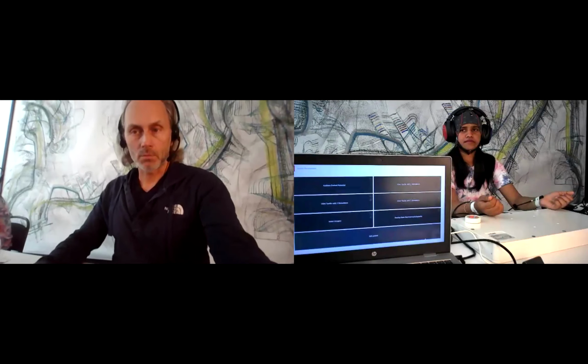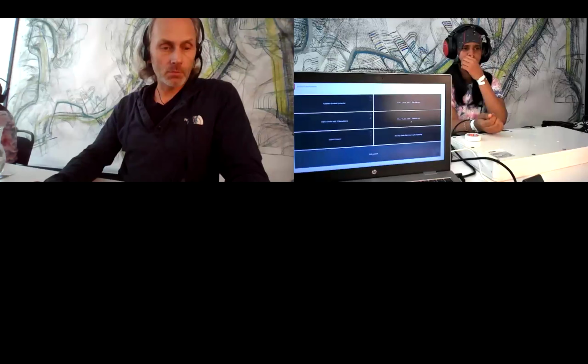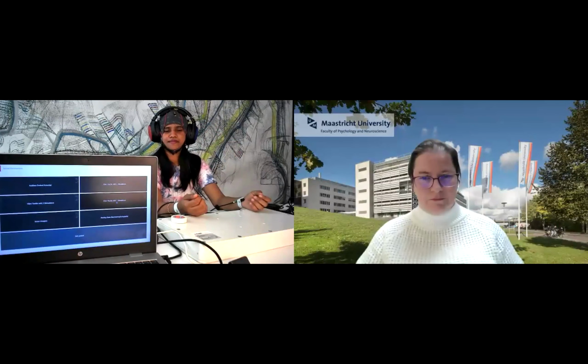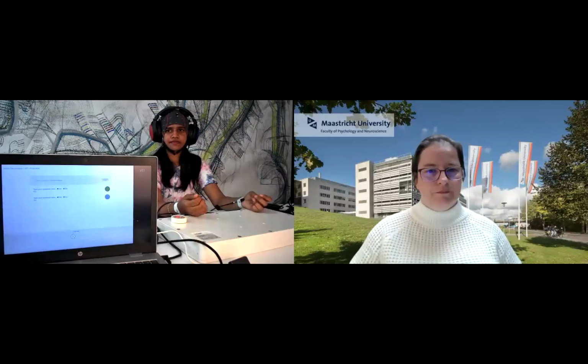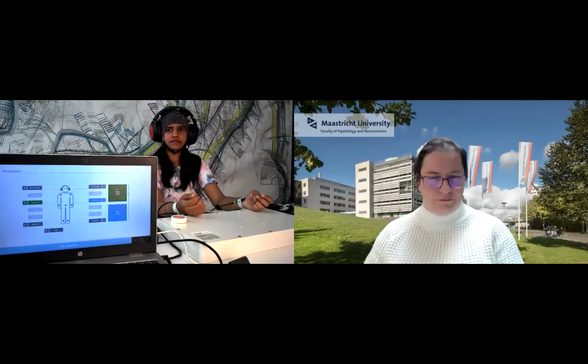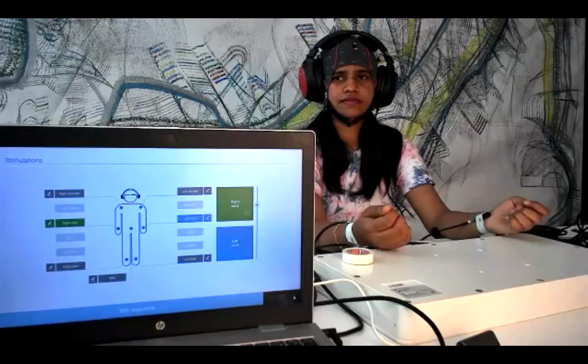And so before I go to answer the questions, I can still show briefly maybe the other paradigms, just showing it without really doing it because of the time. So we have also the VT3 paradigm here. So we have of course assessments. So you see all the locations of all the vibrotactiles. And we have, again, instruction for left and right wrist. So basically, everything is kind of similar to the VT2, but we have a large number of distractors.